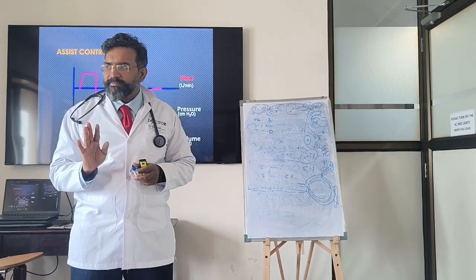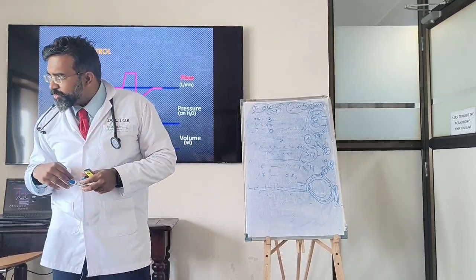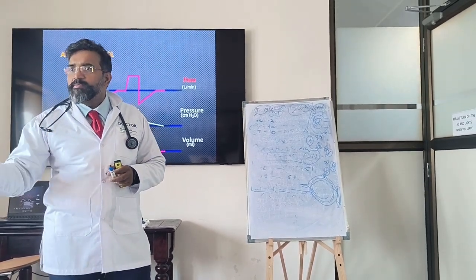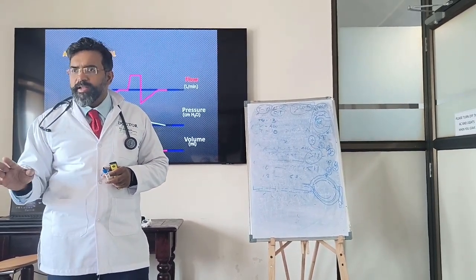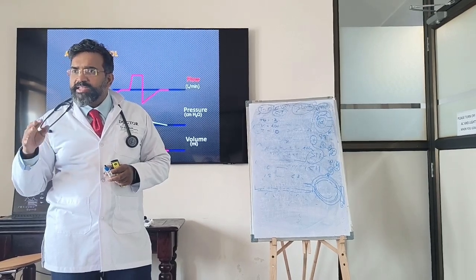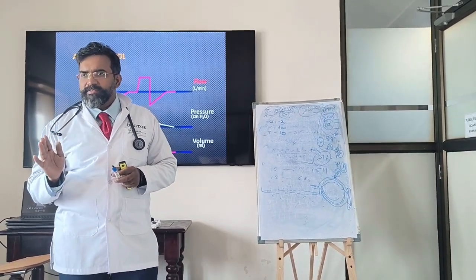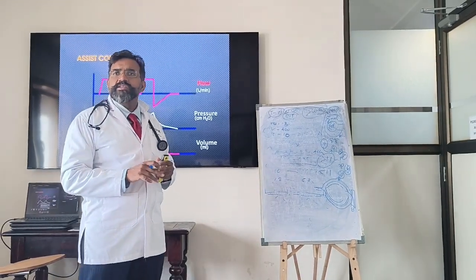Okay? I have set the breath here also. Others think I set the breath so it becomes machine trigger. No, I set the breath. But what is it doing? It is waiting for the time when the patient is taking a breath and then synchronizing with that. Okay? Did you understand, Sachin?